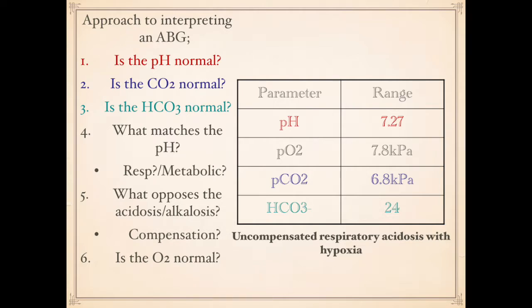So I think you followed that well. Is the procedure we've kind of discussed. And what we've got here is a respiratory acidosis with hypoxia. Okay, so we talk about compensated sometimes, and just a bit of experience for me when I'm meeting some of your colleagues, I think there's a bit of confusion with compensation. So I'd be interested to see what your understanding is of it. When we talk about a compensated, let's say in this case, this is an uncompensated respiratory acidosis. What does that mean?